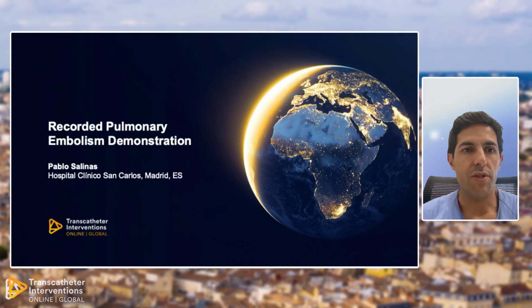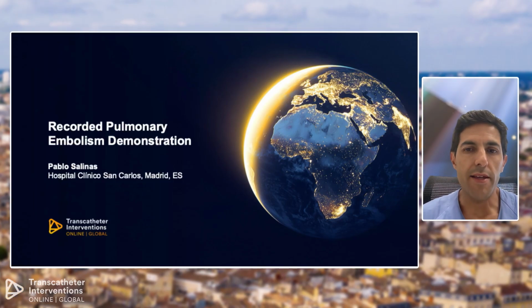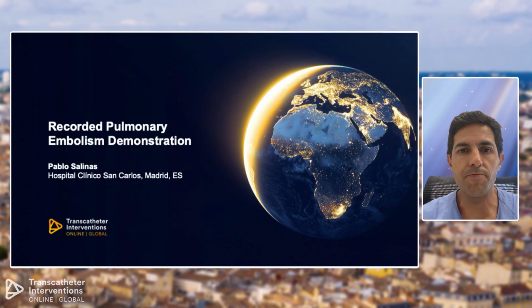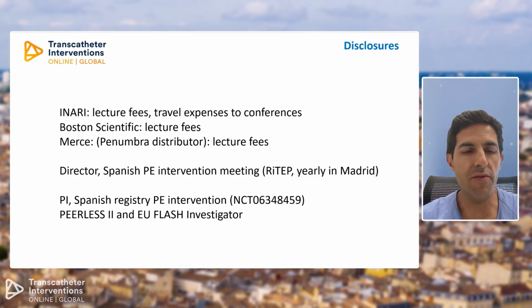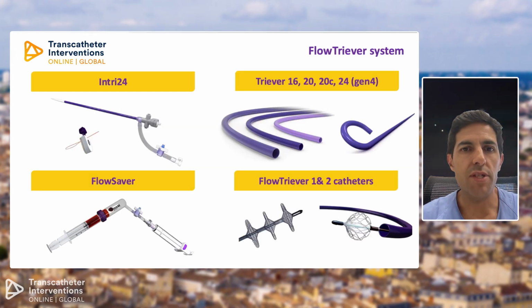So if I can have my presentation, yeah. What I did was to put together 2-3 cases to maximize the educational value of the presentation. These are my disclosures. And I am presenting this system, which is not a single catheter, but a system.